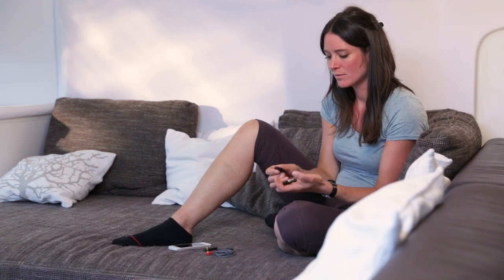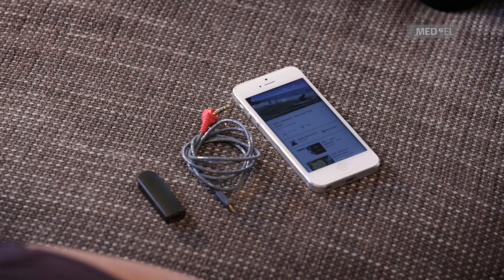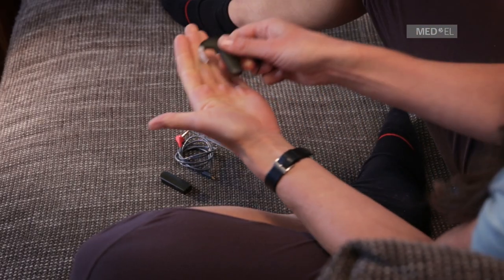To connect directly to an external audio source with an audio adapter cable, you'll need to replace the Sonnet battery pack cover with the Sonnet FM battery pack cover.